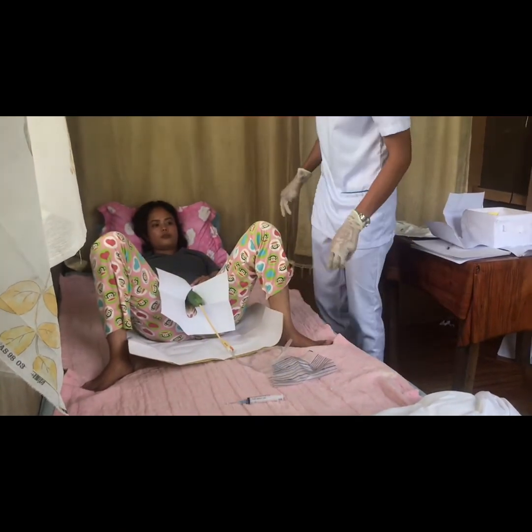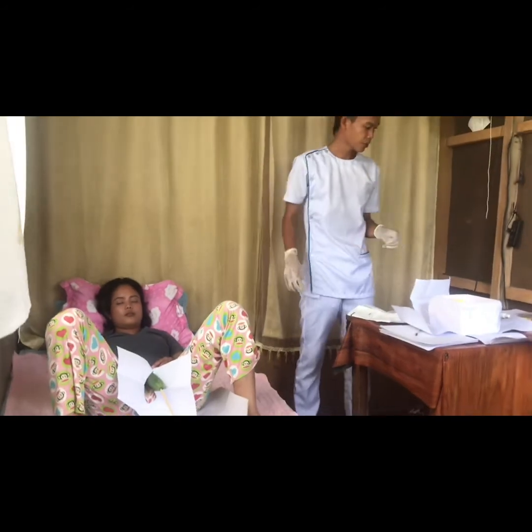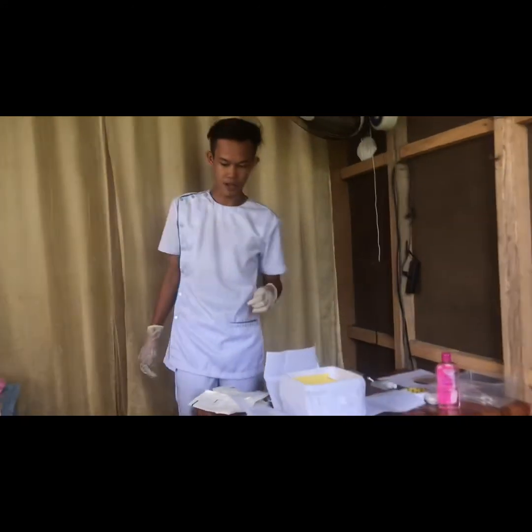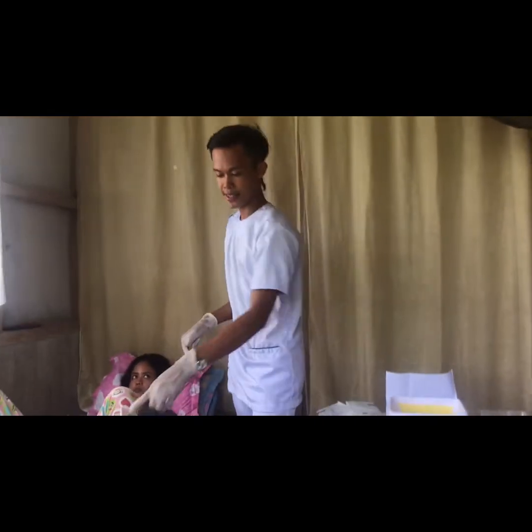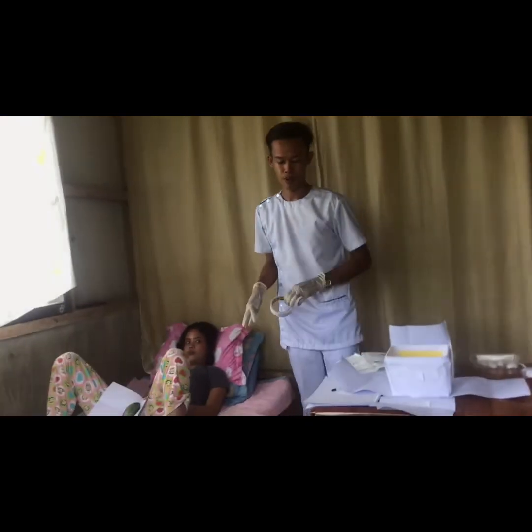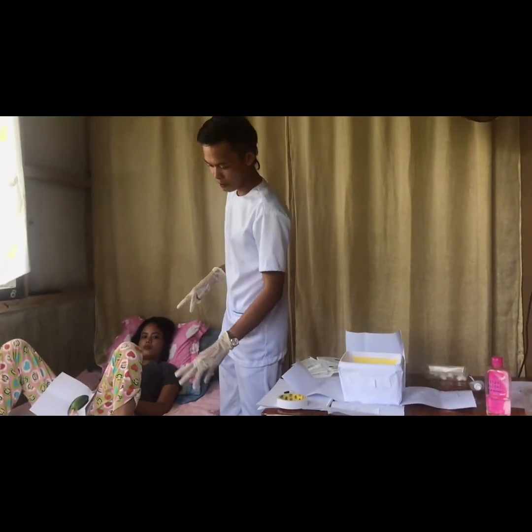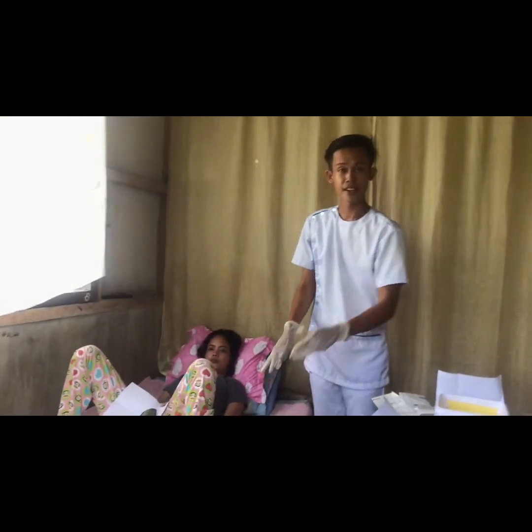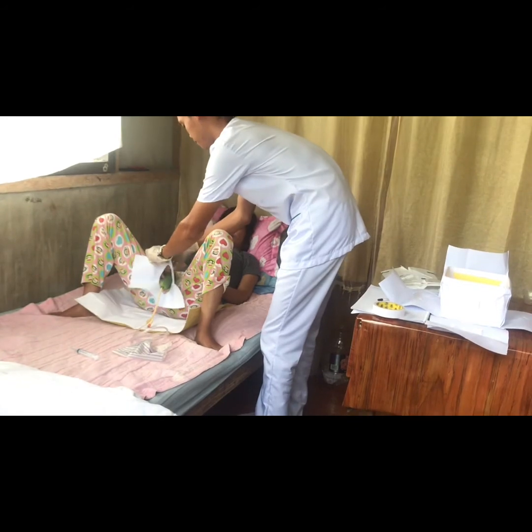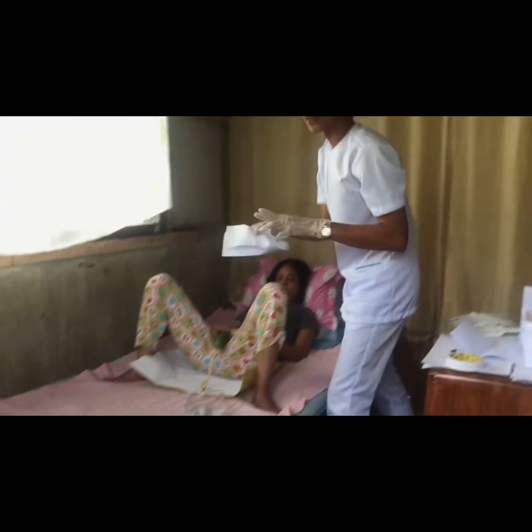Okay. So after we have inserted, I'm going to assess the urine bag of the patient because we are going to place the urine bag on the side railings to make it more comfortable. Before that, I'm going to place it on the side railing of the patient. I'm going to break the penetrated seal. And I'm going to dispose of it.